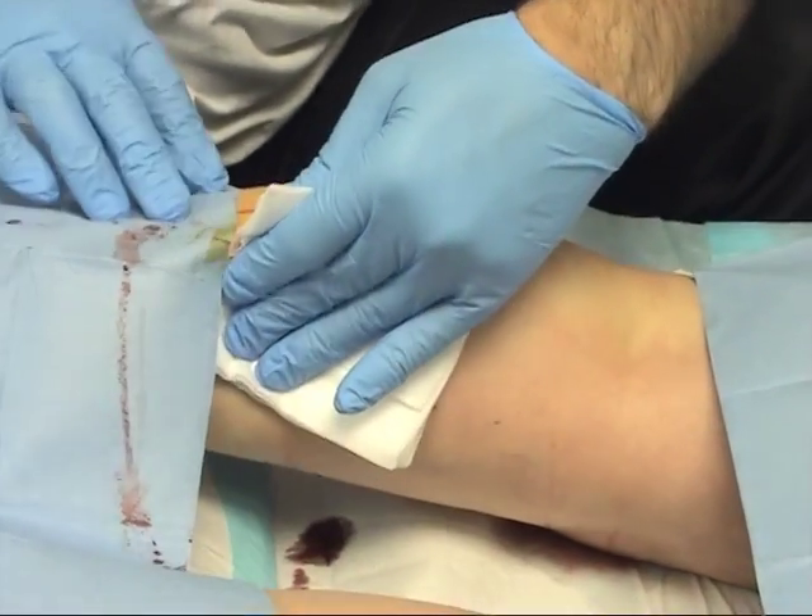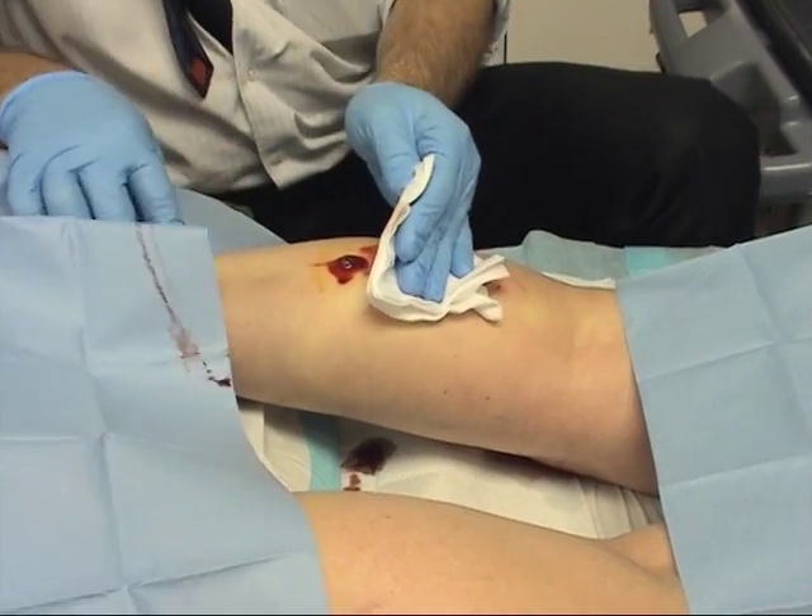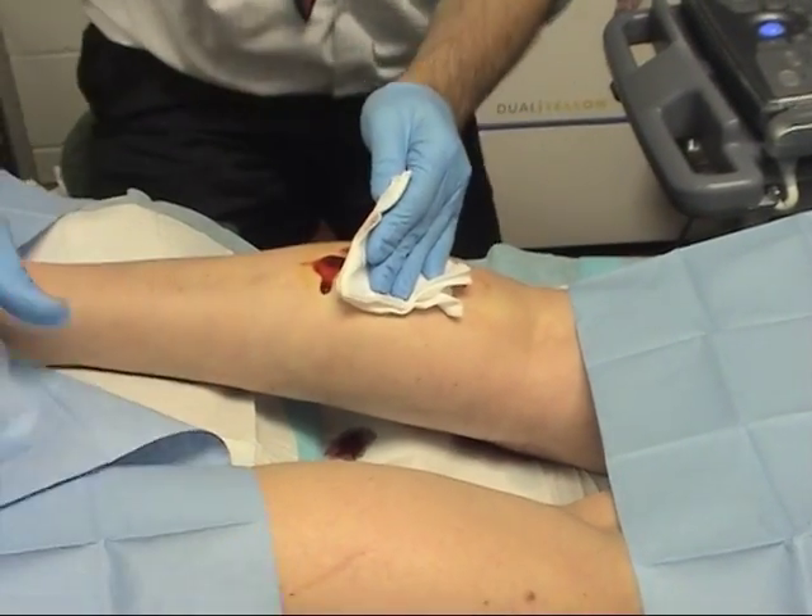That is the lasering done with. You'll get a little bit of blood coming from it at the end just as it clears, and a smell of singeing.